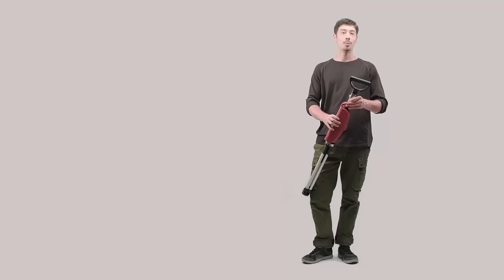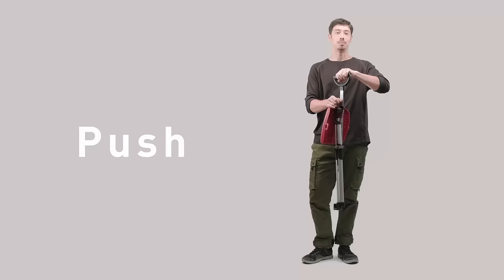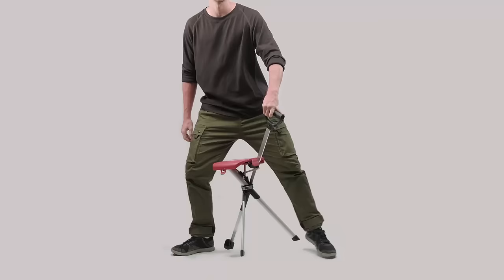It opens in three simple steps. First, open the seat lock. Then push the switch grip downward until the safety clip snaps in place. And just sit anytime, anywhere. Ta-da!